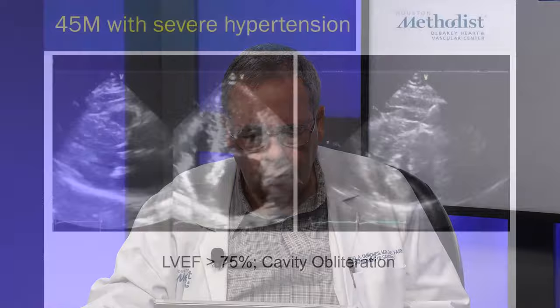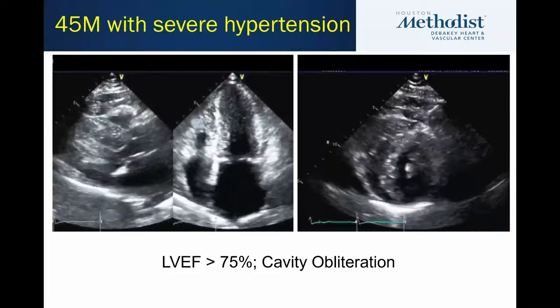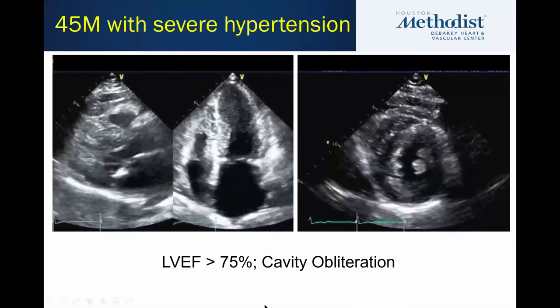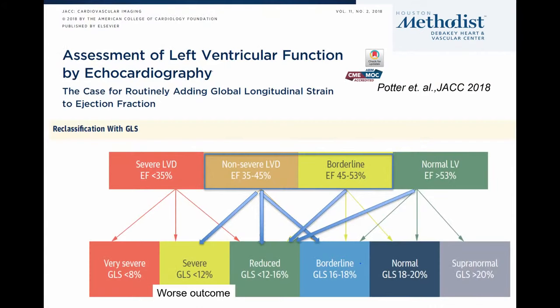Here is a nice example of the divergence between ejection fraction and GLS. This is a hypertensive patient with severe concentric LVH and cavity obliteration — ejection fraction is 90%. And yet, look at the strain curves from the four-chamber, two-chamber, and three-chamber views. There is a lot of heterogeneity visible on the bull's eye, where softer colors indicate lower values. The average is reduced to 14.2%. This illustrates that in the presence of a normal ejection fraction, some patients can have depressed GLS.